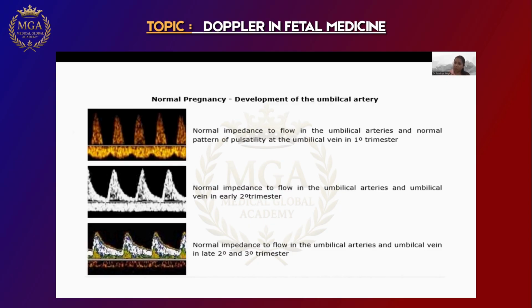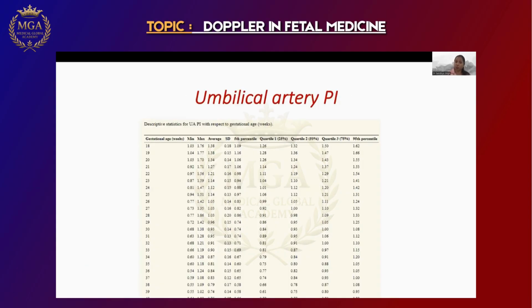As the gestational age advances, the placenta grows, so the resistance for the umbilical artery goes down and the flow increases in the diastole. I have put the images for you over here. And as I was talking, see how the PI changes. At 30 weeks, I'm taking the 50th centile, for example, the PI was 0.93, but by 35 it became 0.8, and by 40 it became 0.77. This is normal, no? 50th centile. So can you see how the PI is decreasing?